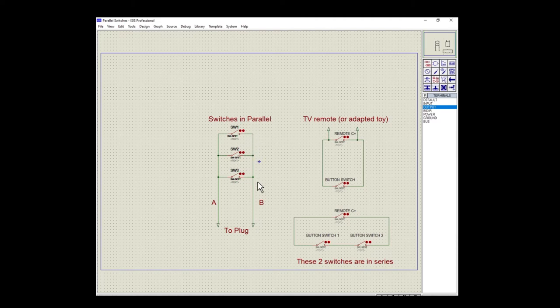Now this is exactly how I adapt toys, and what I did here in adapting this particular TV remote. On the original remote, there is a small button that goes channel up. If you push that button, the channel goes up, of course. That's a fine motor task and also takes some cognition to run. However, I have paralleled the button switch, a representation of just one switch here, into the bottom. So all we need to do is push that big switch, and that's just like pushing the small channel up button on the remote. Remember, it makes no difference what side is connected. All I need to do is just connect it. I can do it here with the adapted switch or their original switch.